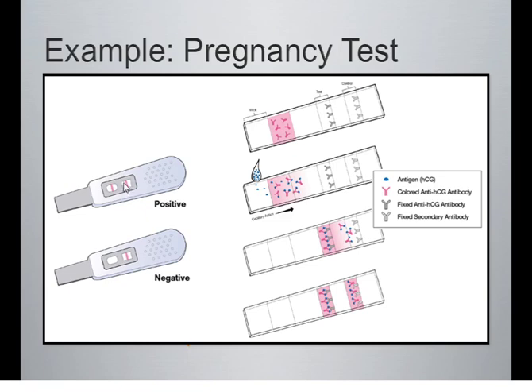You also have to make sure that this is the verification that you actually had the process working. This is where any leftover antibodies that haven't bound to here are going to hit these secondary antibodies right here. These are going to attach to the primary antibodies and basically catch anything that went by, thus saying, okay, it wicked all the way up through.